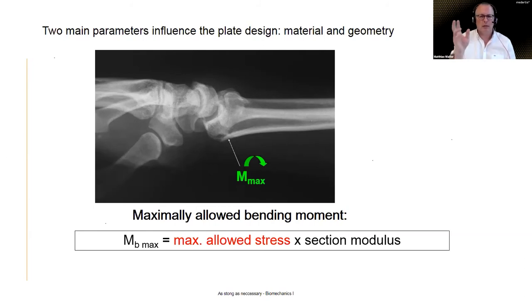So if you take an MRI, you get a very bright image. It looks like a spark. So you can't really use those MRI images for giving a statement. Did you have a good bone healing, yes or no, or is it in a good position? Because it's like looking into the flashlight of a camera, right? You're just blinded basically. And in titanium, as it is non-magnetic, only when you have extremely high Tesla, so when you have extremely powerful MRI machines, there you might see a certain artifact, but in the majority of machines, nothing is really visible, or very, very little artifact, so you can really use it for proper identification. Okay, I hope this answers.